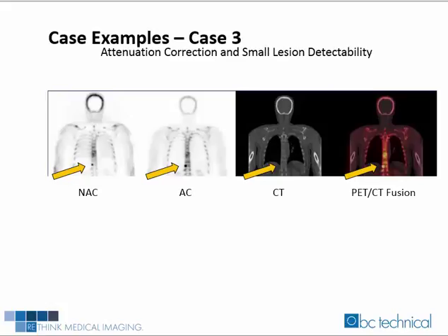On this slide, we see another example of small lesion detectability improvements using CT attenuation correction. On the left is the non-attenuation corrected image labeled NAC, and the attenuation corrected image labeled AC is to the right. In this example, we also see the CT scan along with the fusion image.